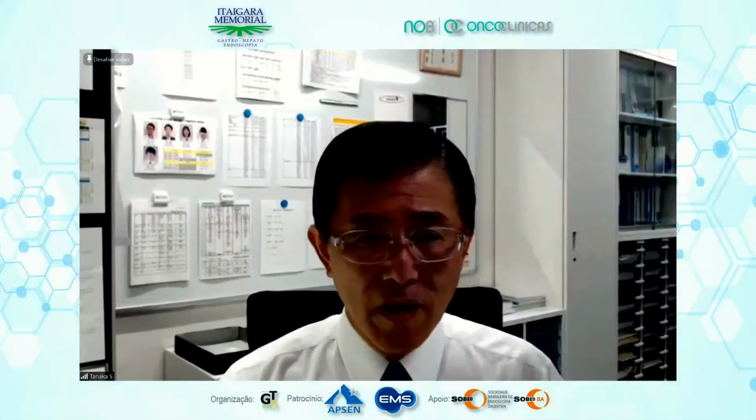A question from Dr. Rox Sanchez from Santiago. Artificial intelligence using chromoendoscopy works for diagnosis and to decide between resection or leaving the lesion as a strategy. Do you think that we could use artificial intelligence for regions with difficulty in access to techniques? Yeah, now AI is remarkably developing.